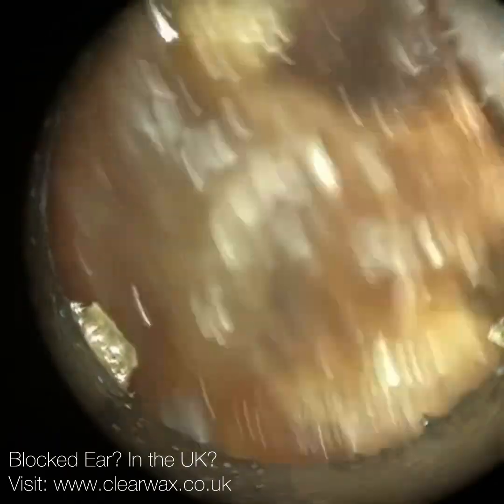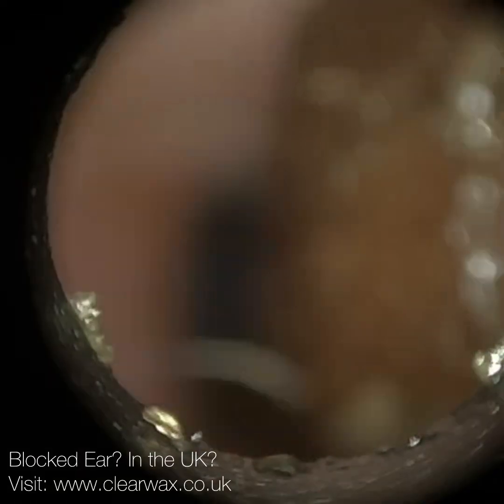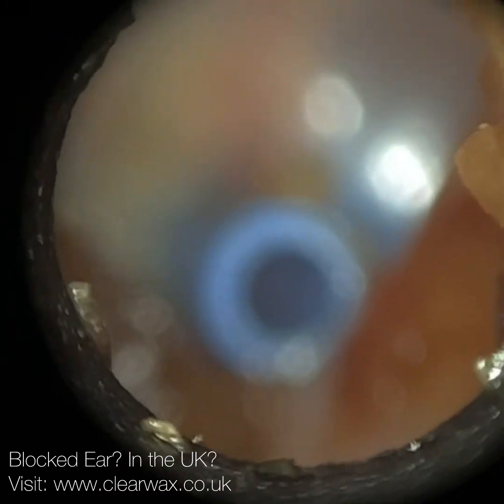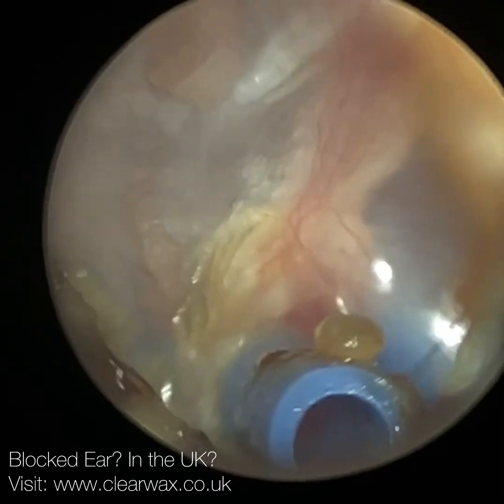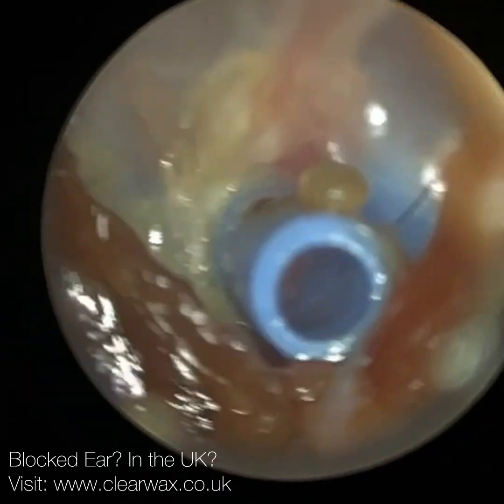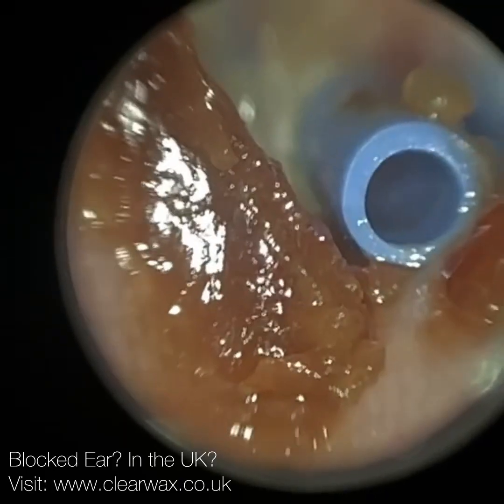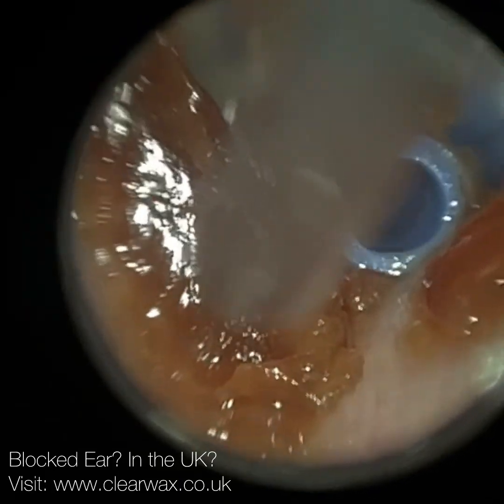The eustachian tube is a narrow orifice which connects the middle ear - the cavity behind the eardrum - to the back of the nose, the nasopharynx. And there's that T-tube, the blue ventilation tube. The function of the eustachian tube is to equalize the middle ear air pressure. We want the air pressure in the middle ear to be equal or equivalent, more or less, to the atmospheric air pressure - the air pressure in the ear canal.